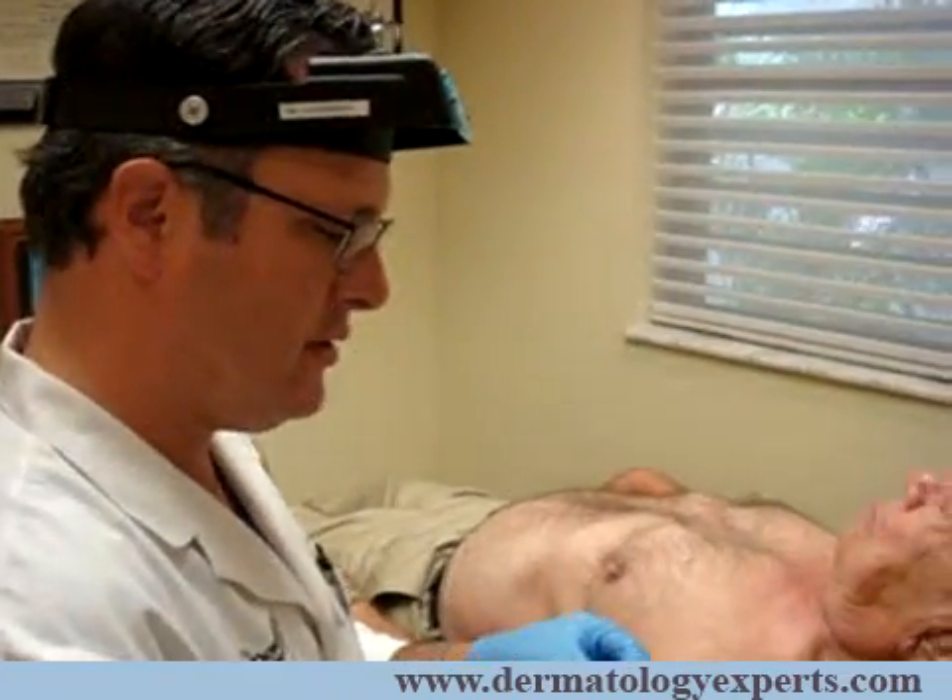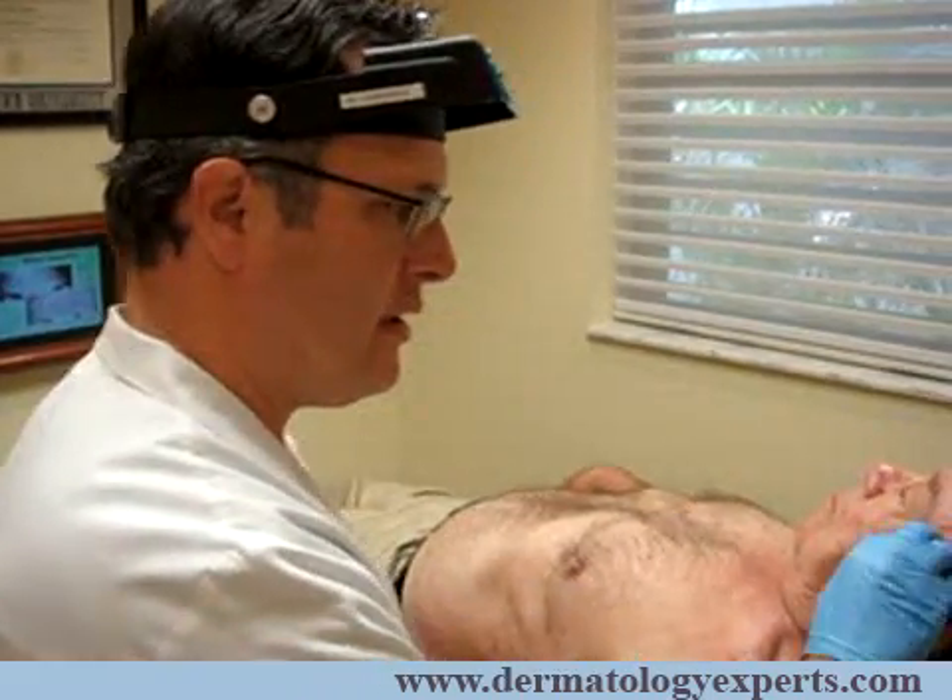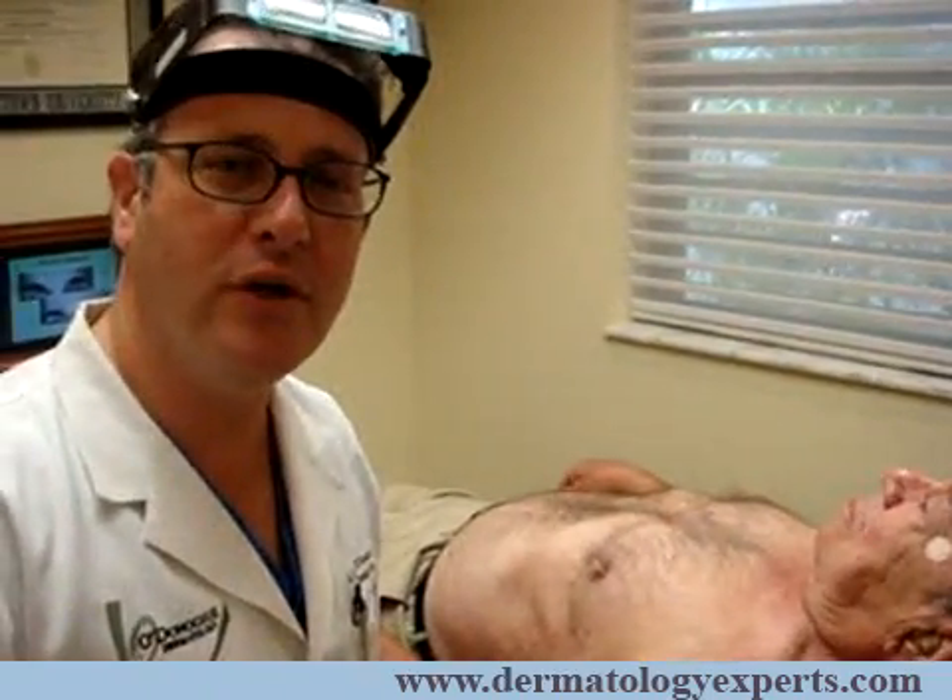Then I'll place just a tiny band-aid on the spot, along with just a little bit of polysporin or neosporin, and the patient's all set. This is Dr. O'Donoghue from O'Donoghue Dermatology demonstrating a skin biopsy. Thank you.